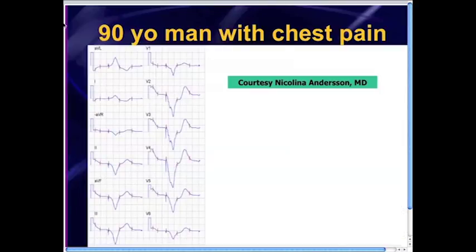All right, so going back to this baseline, actually let's skip over this and let's go back to Dr. Anderson's EKG. The EKG gives us nice little hash marks to point out the J points, and this lead and this lead, this lead, this lead, and so on. These are all okay because you've got normal expected discordance of the ST segments, but where is it abnormal? Let's take a look at V1. QRS mainly points downwards, so we expect to see isoelectric or maybe a little bit of elevation of the J point, and that is present, so lead V1 we're happy with.